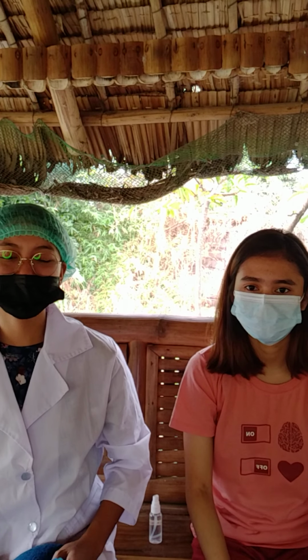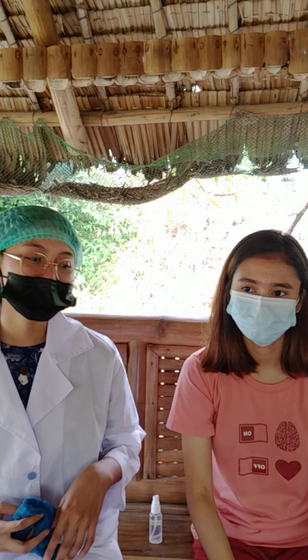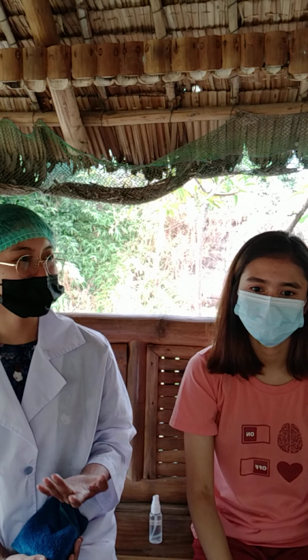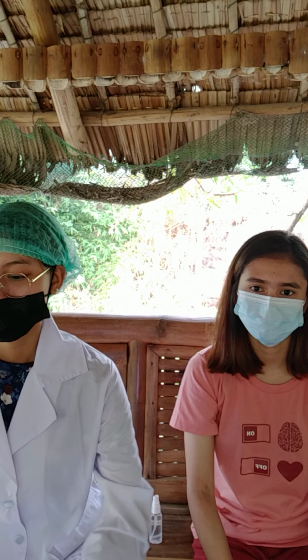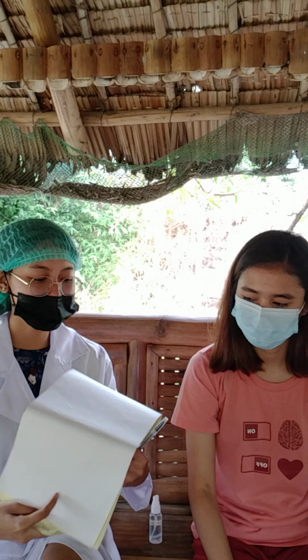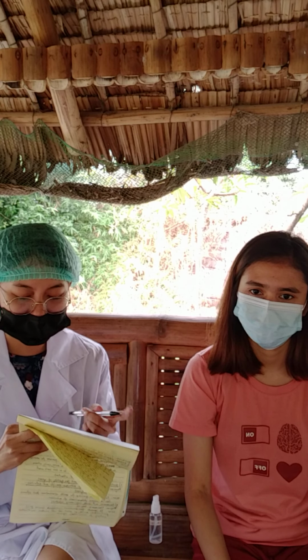And then after that, for the evaluation, the blood pressure is measured accurately and without any injury to the client. And then for the documentation, record the findings on paper or a computerized record. So, ma'am, yung blood pressure nyo po is normal lang po siya, ma'am. So, 120 over 80 po siya.